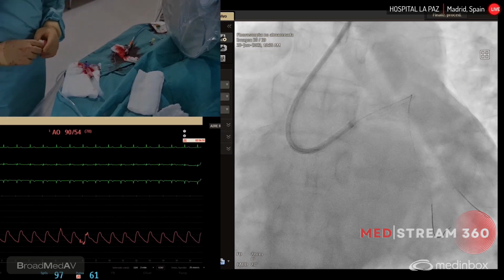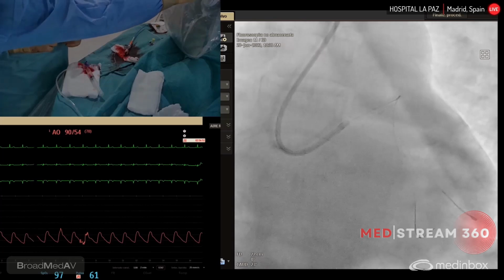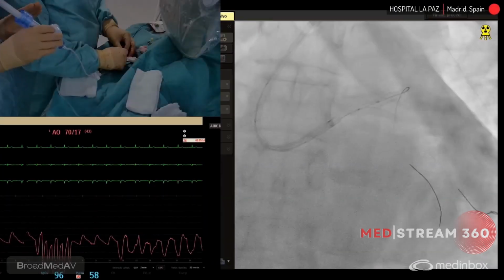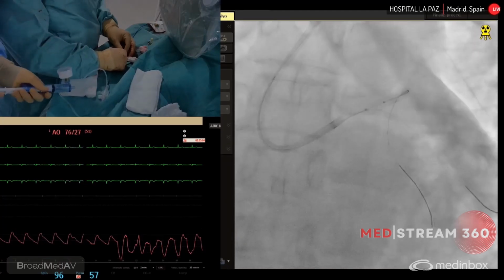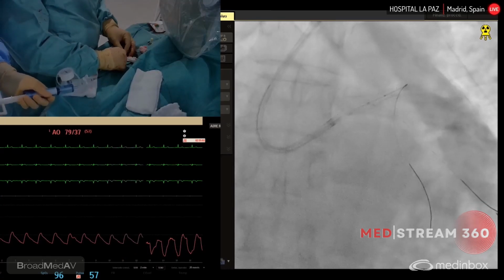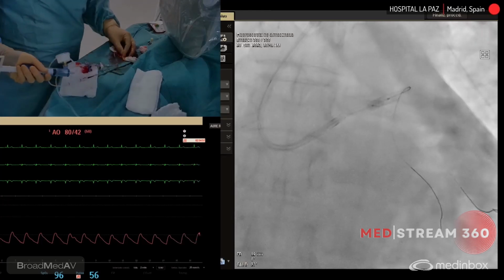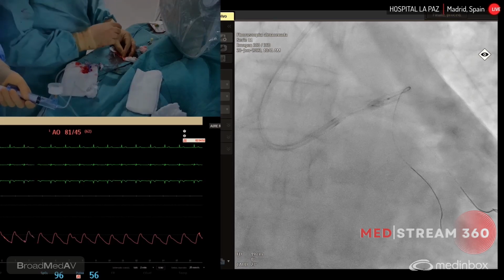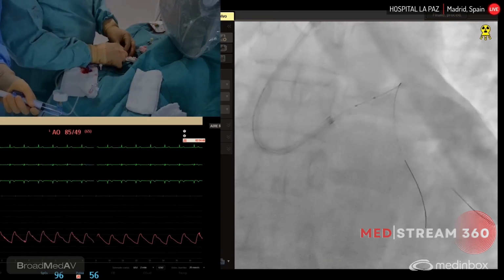And the proximal lumen of the left main with IVUS was 3.9. So we are using a 4 balloon, 3.86. I think we inflate in the ostium at low pressure. It was a little bit underexpanded. Now the real POT. Okay, we are there. Okay. Down.